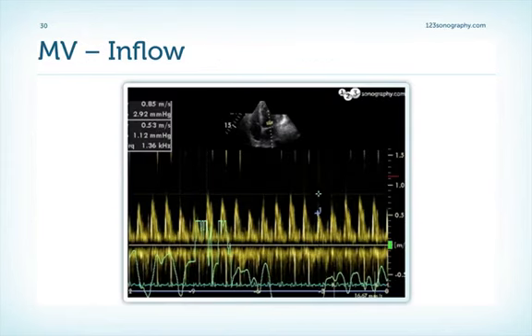To demonstrate the interventricular dependence, you also use Doppler. Place the pulsed wave Doppler at the tips of the mitral valve leaflet and turn the speed with which the tracing runs as slow as possible so that you get many beats within the field of view. Then you will see fluctuations in the inflow velocity, and the lowest velocity is found exactly at the time point when the patient inhales. This reflects the impaired filling of the left ventricle during inspiration caused by the hemodynamics that we discussed earlier.